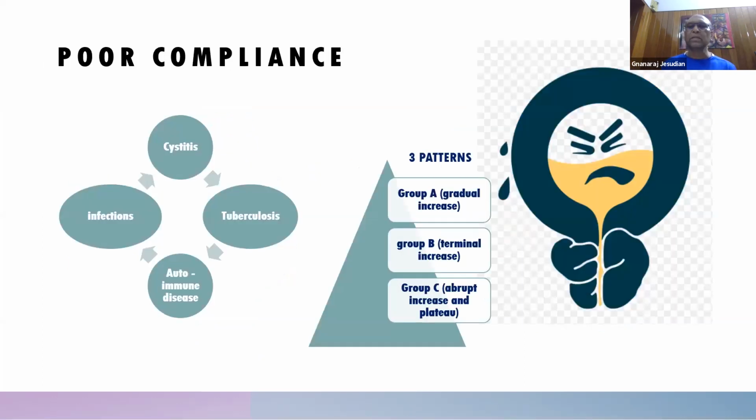The next thing which the doctors would like to interpret is what is called compliance. We said compliance means the elasticity of the bladder. We saw last time that from the volume of about 50 to 100 ml to 400 ml, there's hardly any increase in pressure inside the bladder. This is because of the way the muscle fibers are arranged; when it expands, there's no increase in pressure.